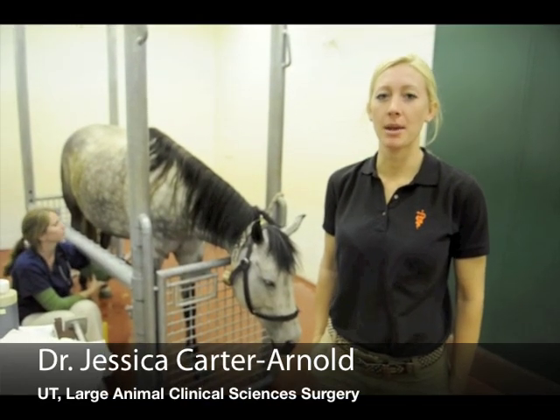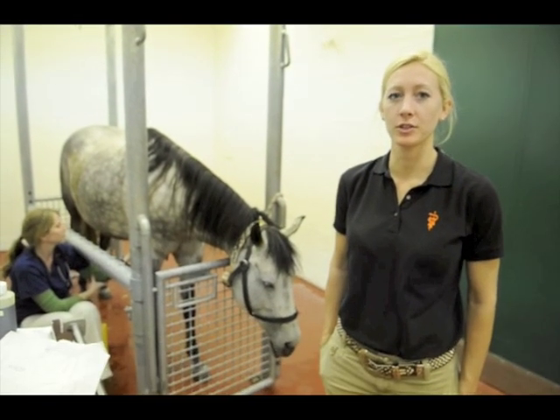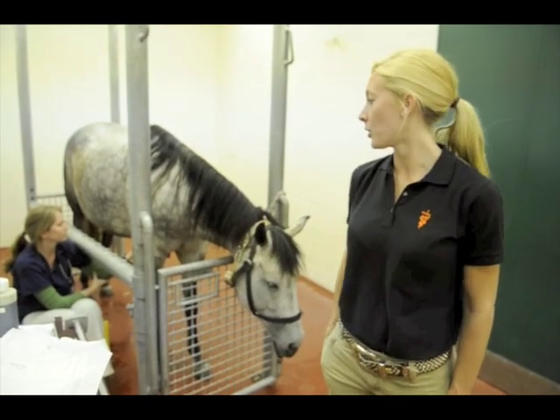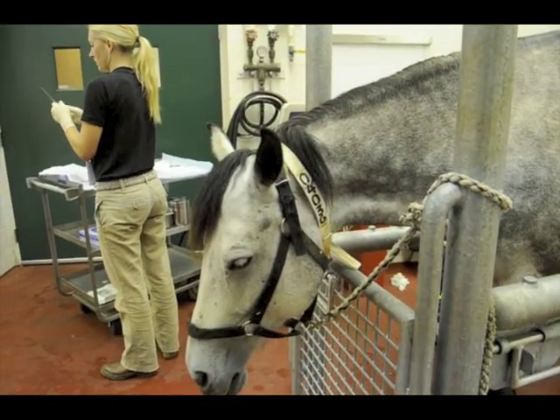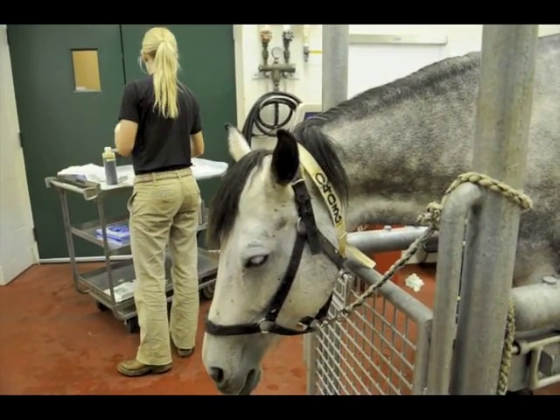Today we performed a bone marrow aspirate from the sternobra of this horse mare. We did this in order to harvest allogeneic stem cells from that bone marrow aspirate.